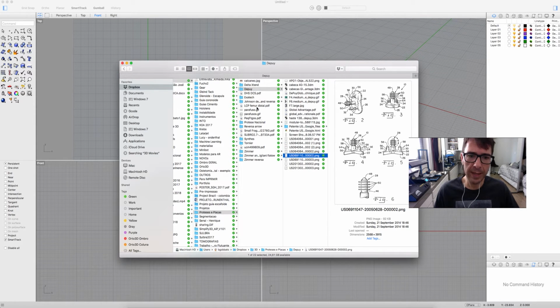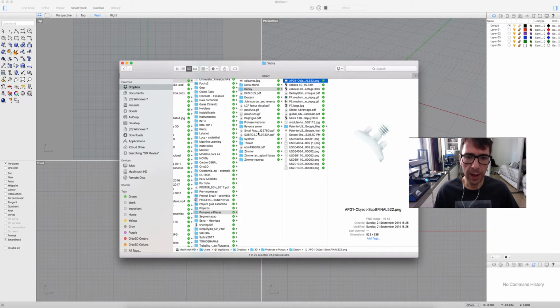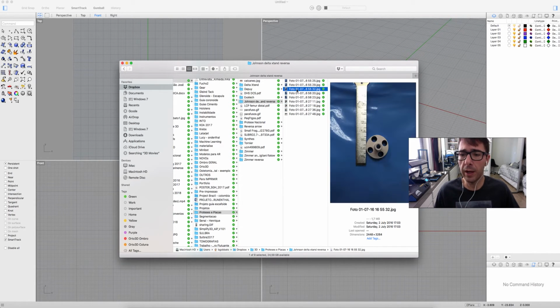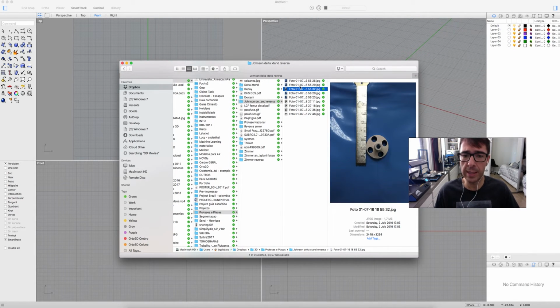This is from the patent. Let me see if I have some other pictures to show you guys how we can design this using pictures. Here is an example of a Johnson implant. We took pictures with a scale, with a ruler, and we use this as a reference. So this can be done using only pictures.